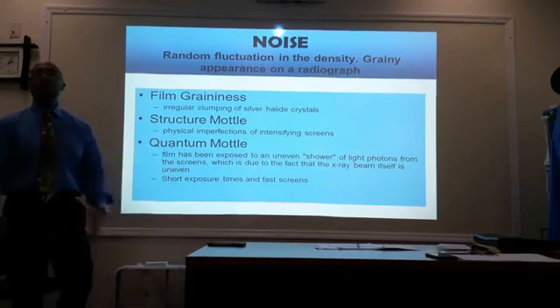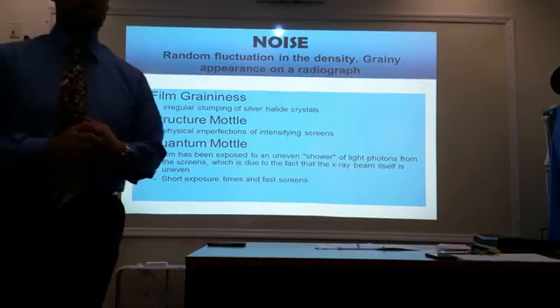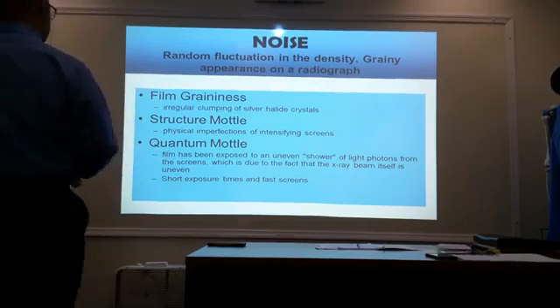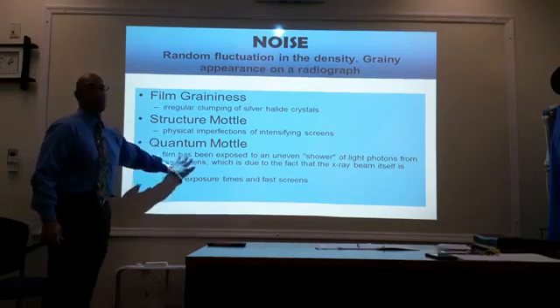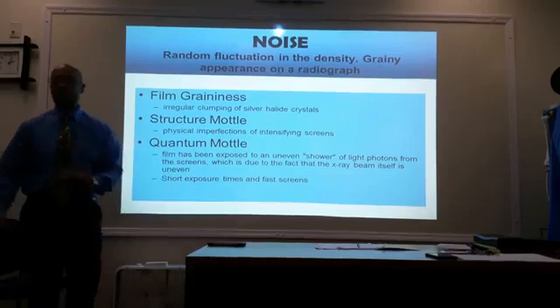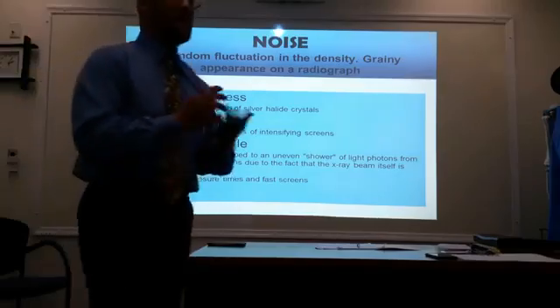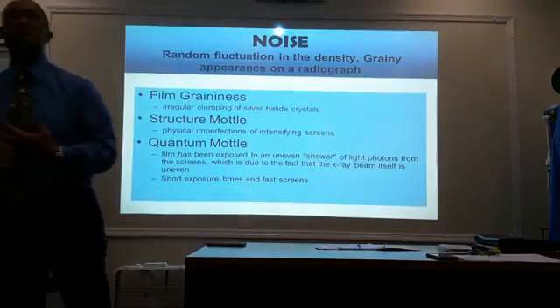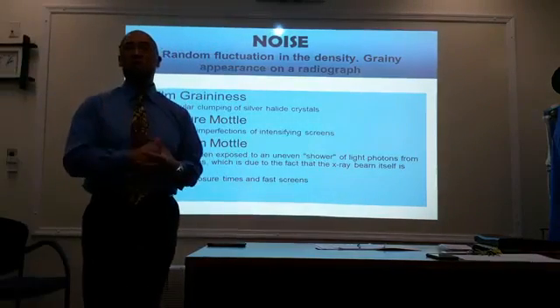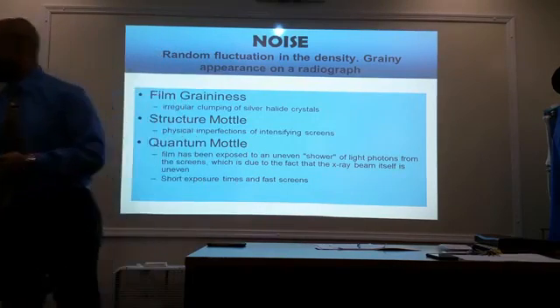The last one here has to do with your technical factors. Before you read on to this, I'm just going to show you an example of what quantum mottle is. It happens when you have short exposures. Very short exposure time. Very, very quick. Okay? You guys ready?